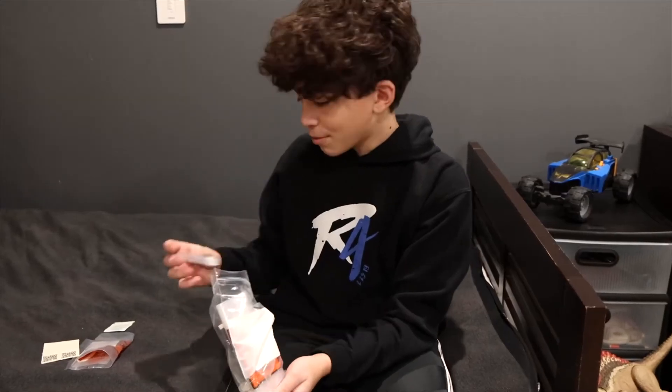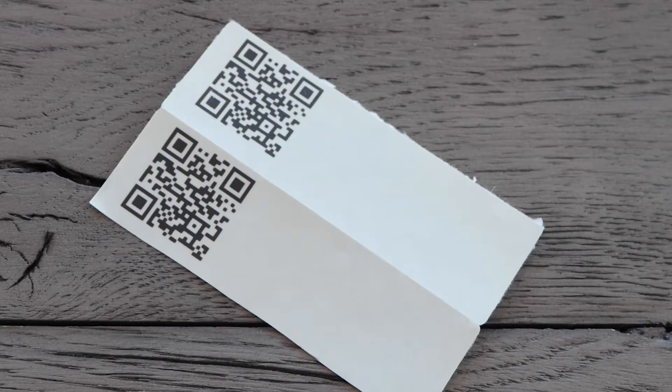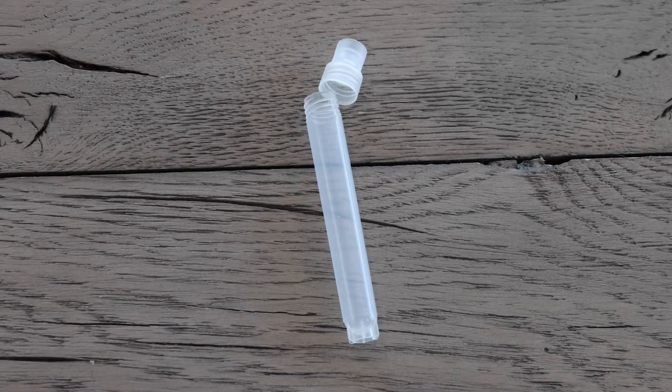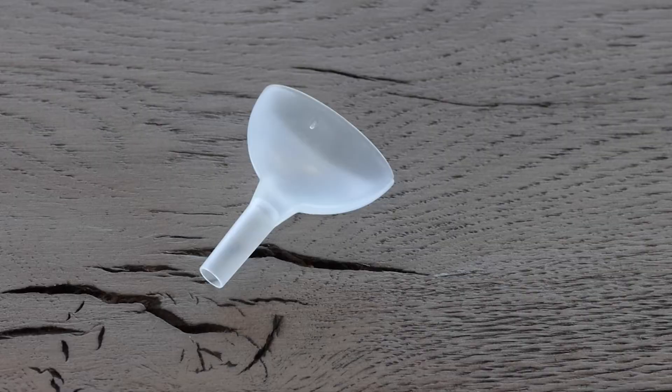Inside each kit, you should have a biohazard bag, a QR code sticker, a sanitizing wipe, a collection tube and cap, and a funnel or straw.